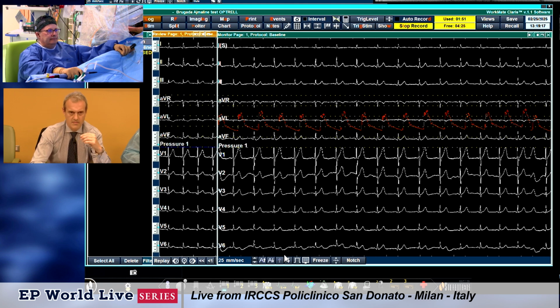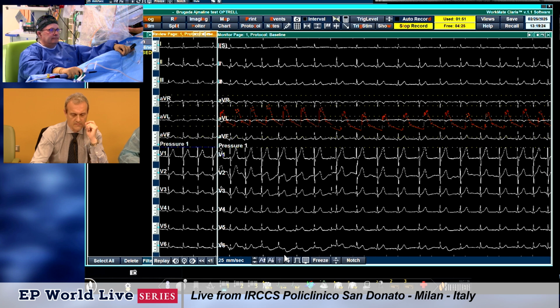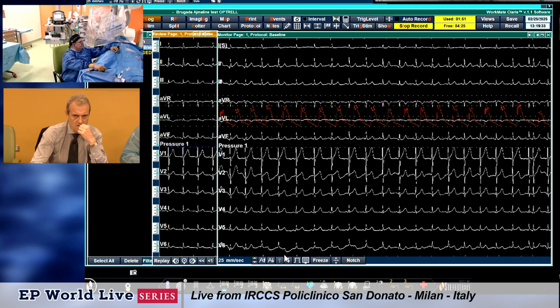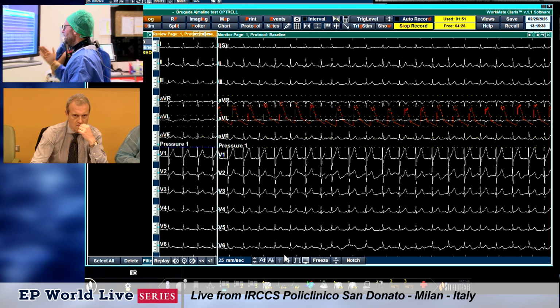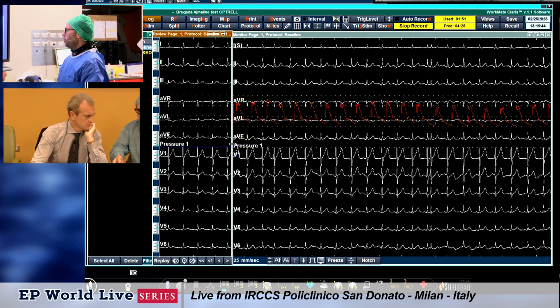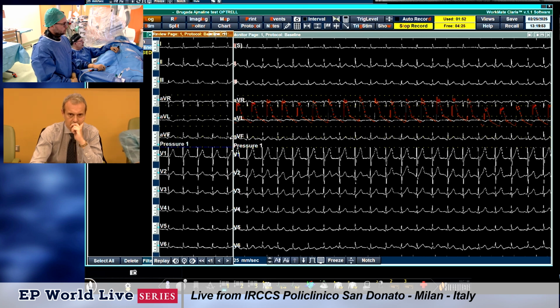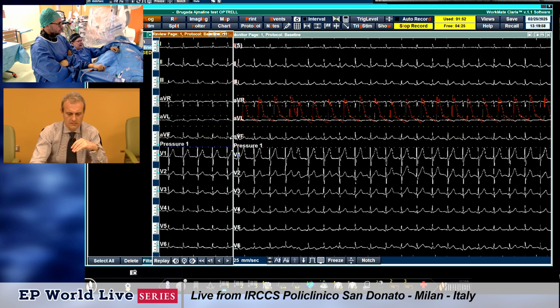We can clearly see if we compare before and after: you have before, at the beginning of the procedure, on the left side, and now the live screen on the right side. You see that we had a kind of depression of the ST elevation that was more evident in the inferolateral leads, and now looks more flat, more flat towards the isoelectric line. In this moment, the EKG is normal. No more early repolarization. You see lead 2, lead 3, and AVF, no more early repolarization.